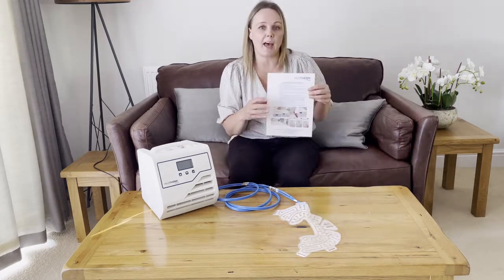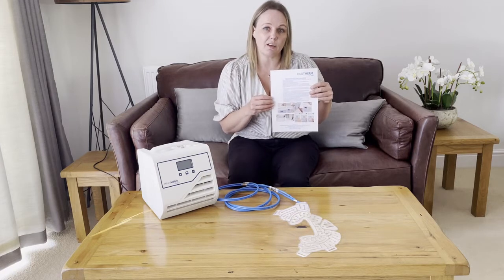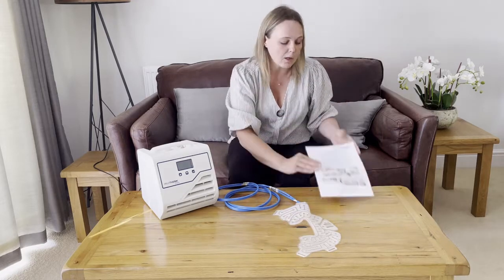First of all, you should have access to an instruction laminate — please look out for this, it's very useful. It has step-by-step instructions for using the device on the front, and there are also some useful hints and troubleshooting guides on the back as well.